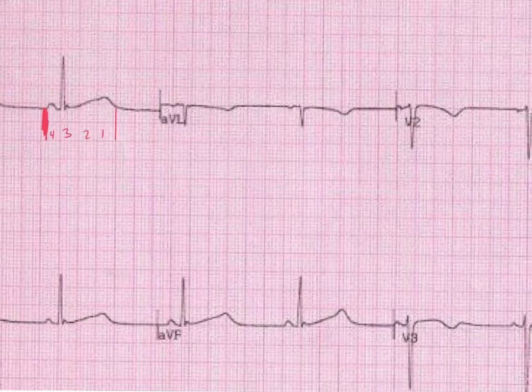So that's 0.2, 0.4, 0.6, 0.8. Well, I thought you started on the Q, not the... Oh, whoops, yes. Thank you. Nice catch. So 0.6. Yeah, so there we go. 0.2, 0.4, 0.6. So that is approximately 600 milliseconds or 0.6 seconds. Good catch there. So definitely prolonged.